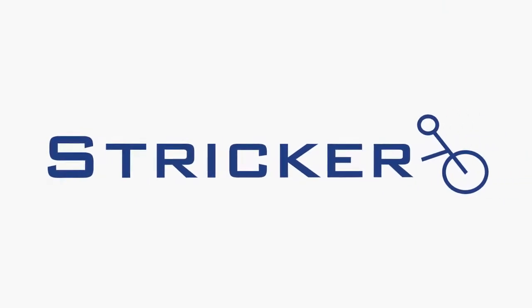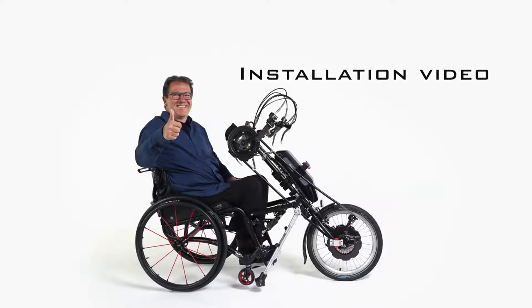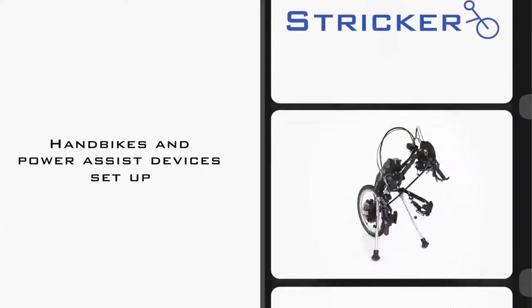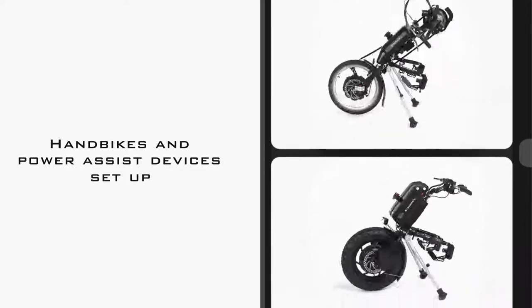We are happy that you have chosen a handbike or power assist device from Stricker. Thank you for your trust. In this video we show you step by step how you can easily set up our handbikes or power assist devices.